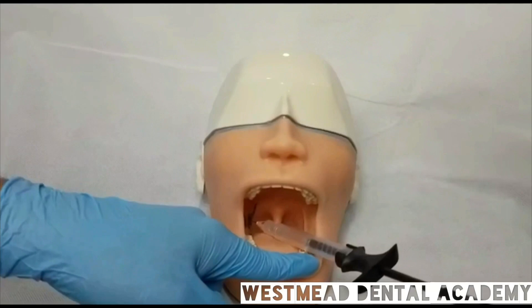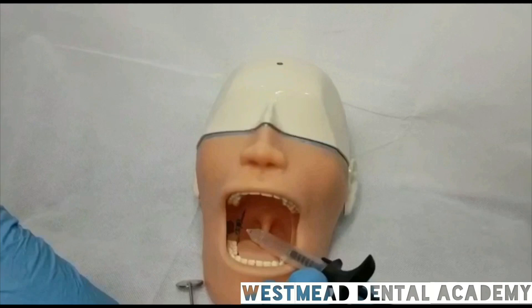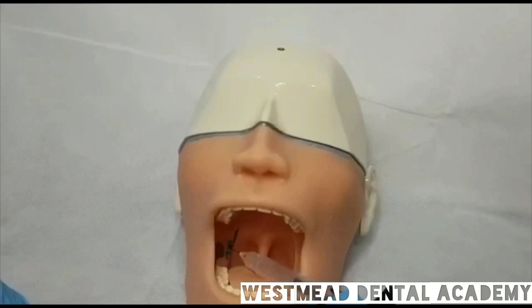So, I have turned the mannequin head now, because you also need to see the green light on. That means you have done the technique properly. So, you can deposit the local anesthetic solution after you withdraw the needle 2 millimeters backward.